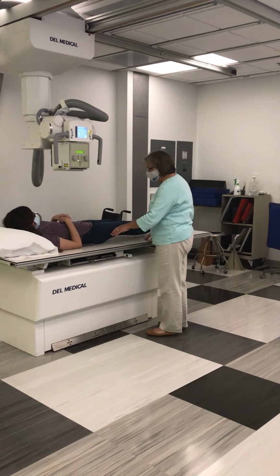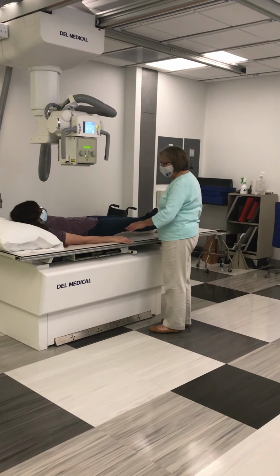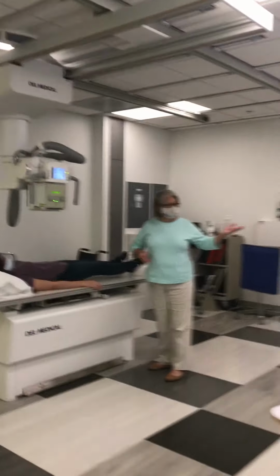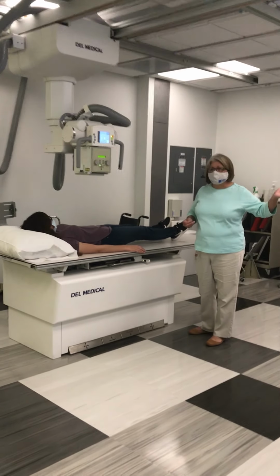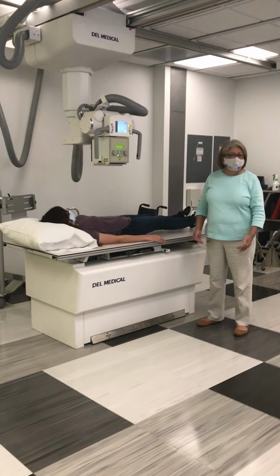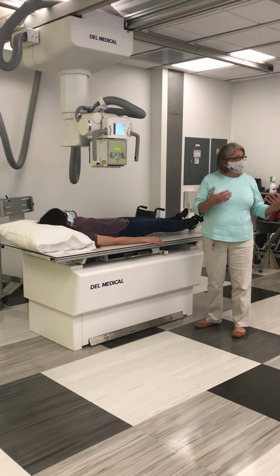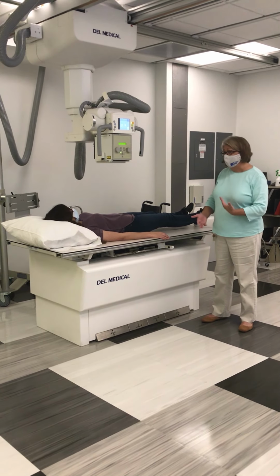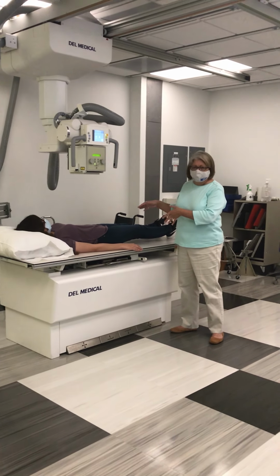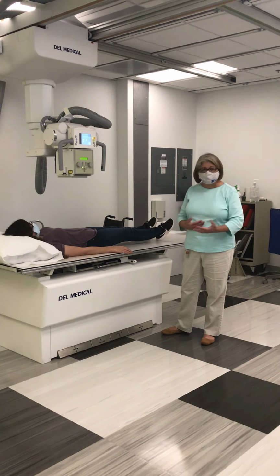Ma'am, I want you to just put your hands on the table and move your hands slightly away from your body. Thank you. And this is similar to when you perform the chest. When you're doing your simulation, your patient may stand at the wall Bucky with their feet separated already, shoulder width apart. But I need to hear you tell your patient to do that so that I know that you know to do that. The same here with the arms away from the body. Your patient may be lying like that, but I need to hear you verbalize those instructions to your patient.